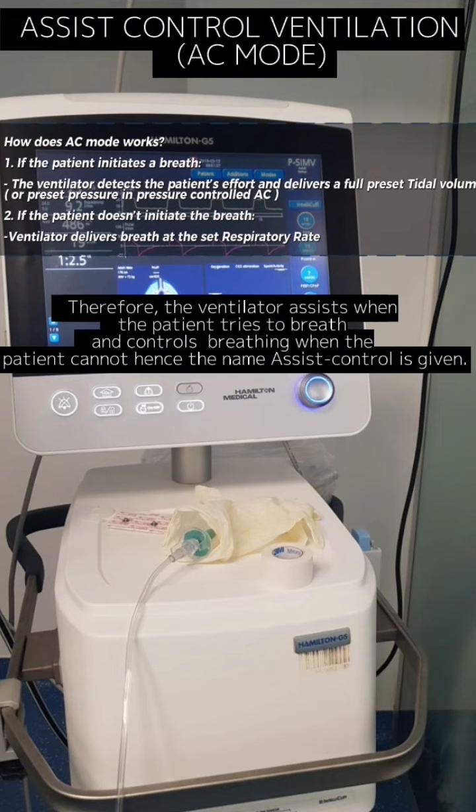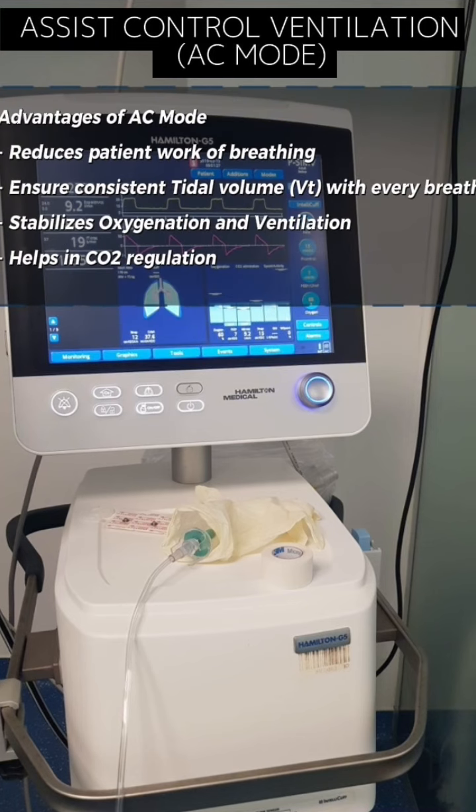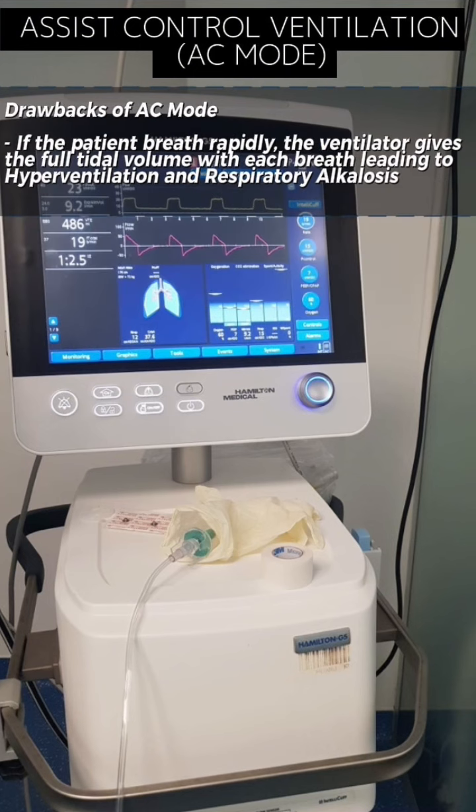So, when is AC mode used? It is used when there is weak spontaneous breathing effort, a semi-conscious or fatigued patient, early phase of mechanical ventilation, respiratory distress or unstable breathing pattern, to ensure adequate ventilation with minimal patient work. So, let's talk about the advantages of AC mode. It reduces the patient's work of breathing, ensures consistent tidal volume with every breath, stabilizes oxygenation and ventilation, and is good for initiating mechanical ventilation. And lastly, let's talk about the drawbacks of AC mode.